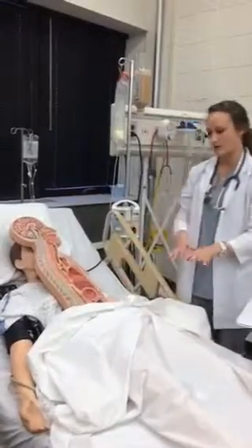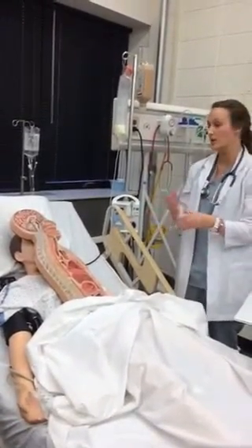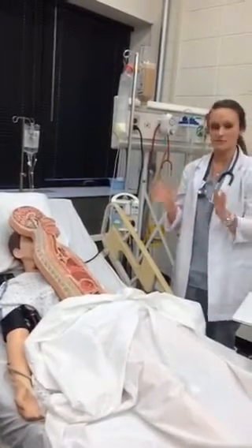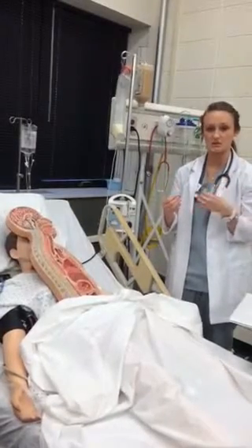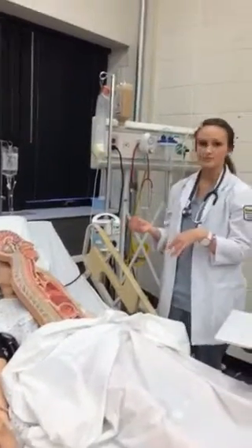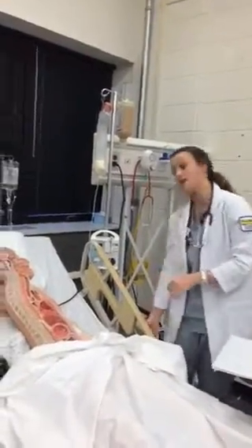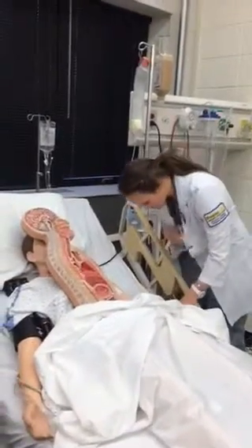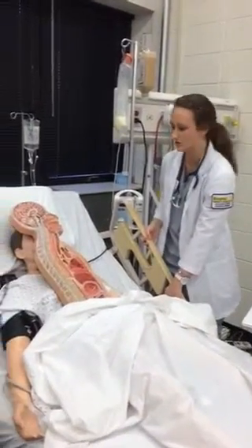So once the abdomen's okay, then I'm going to go ahead and establish a stop signal with my patient. So whenever I insert it through the nose and it hits the back of the throat, they can give me their stop signal. That means that they can stop for a second, take a drink of water, put their head down, and we can insert the tube a little bit further. And I'm going to make sure that the patient is in high Fowler's. So at least a 90-degree angle.